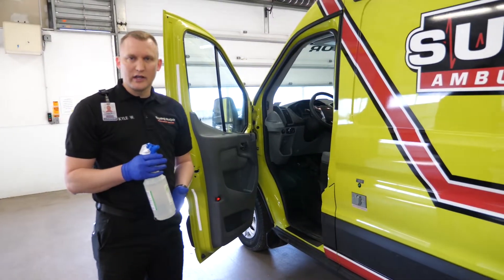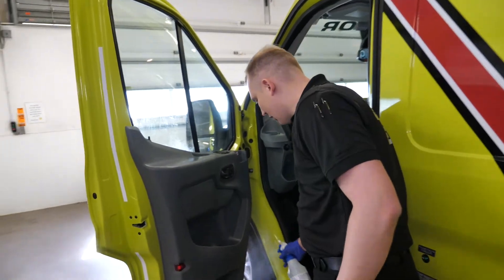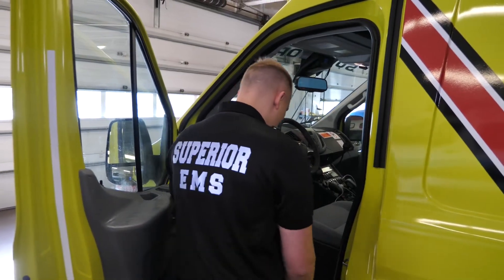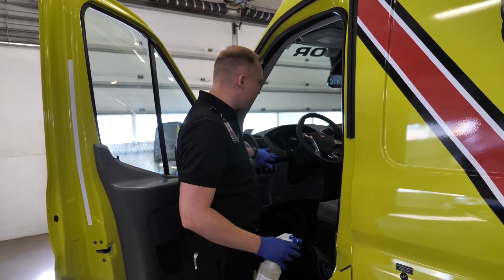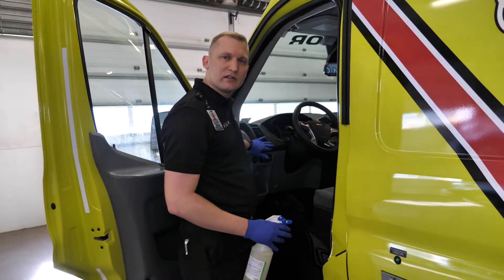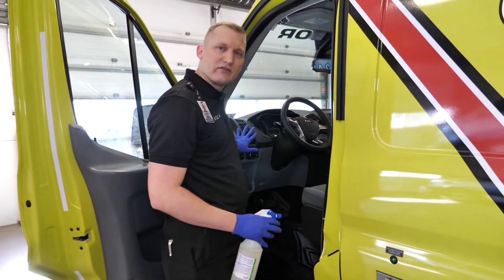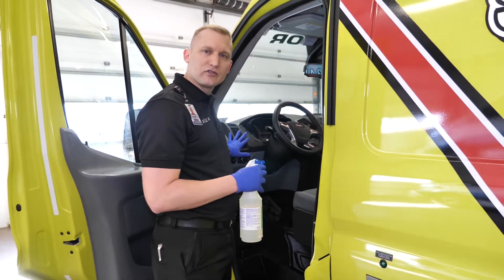Let's start in the front of the ambulance. You want to take your solution and spray the mist over the entire surface of the front of the vehicle to ensure good coverage and a good amount of moisture on all surfaces. We want to let that sit for two minutes to allow for the decontamination to process, then let it air dry. It's important to note I did not spray the entire front of the vehicle for demonstration purposes.